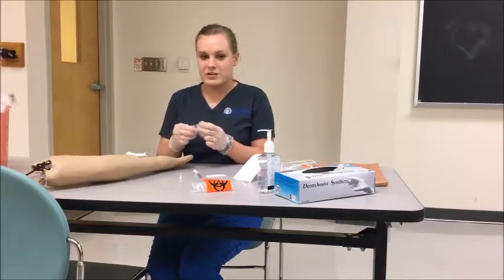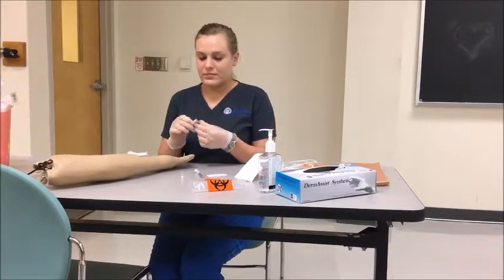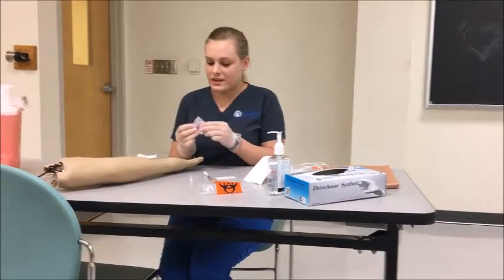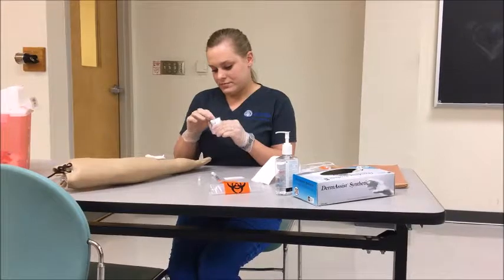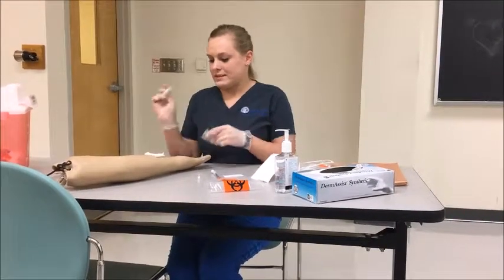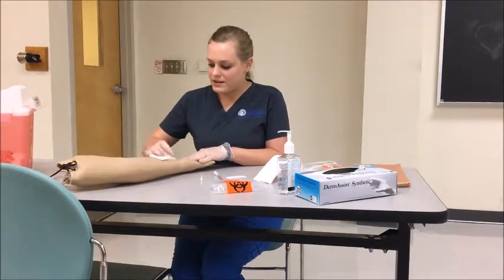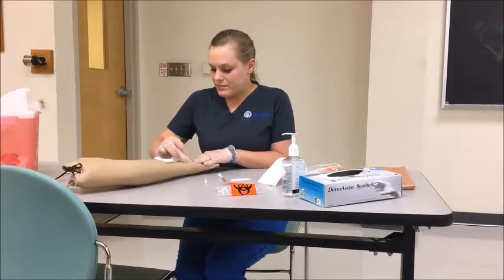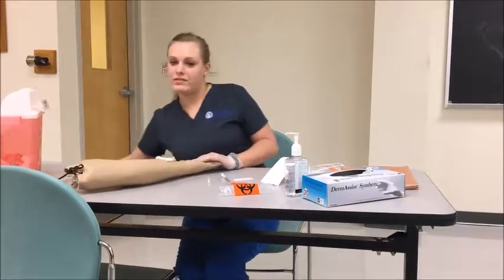Before I start, I make sure the patient is stable enough for this procedure — not hyperventilating or panicking. If so, I would just calm them down. Then I get an alcohol wipe to prep the radial site I'll be using, cleaning it thoroughly, and disposing of the wipe.